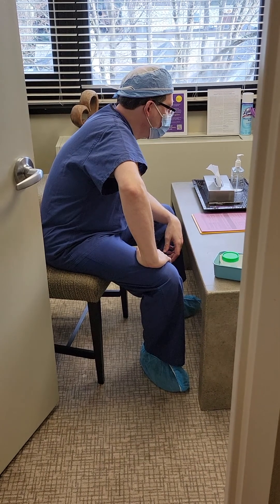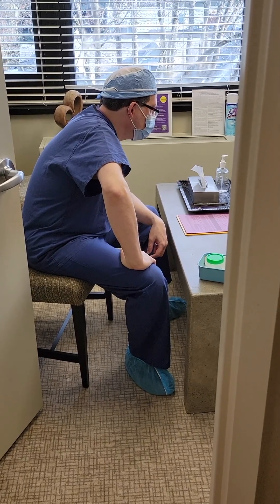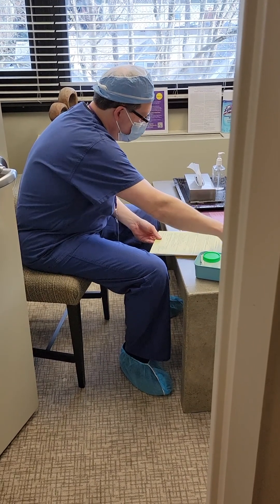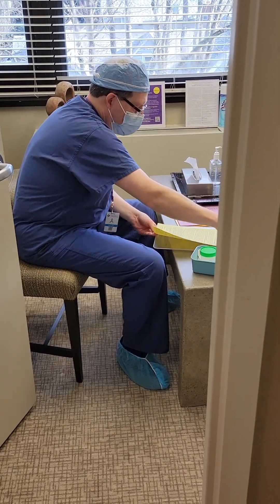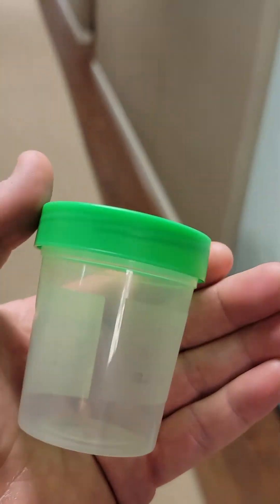When you come to New England Fertility for your semen analysis, you'll meet with an andrologist — and here we have our andrologist, Andrew. You'll sign some paperwork, you'll receive instructions, and you'll get the cup for your sample, and then it's time to head to the collection room. And no, you don't have to fill this cup. The average ejaculation is only about a teaspoon, and we don't even need that much — we'll explain why later.